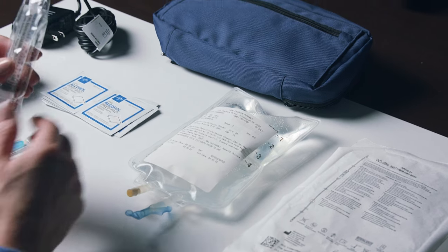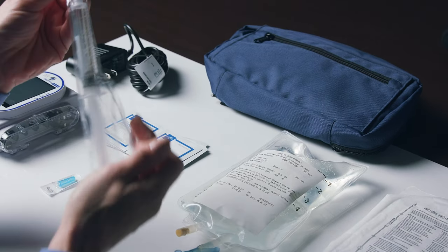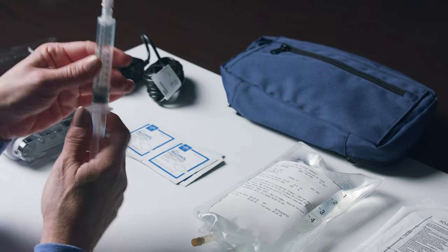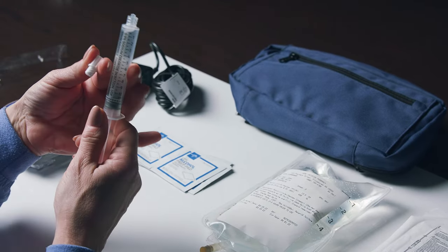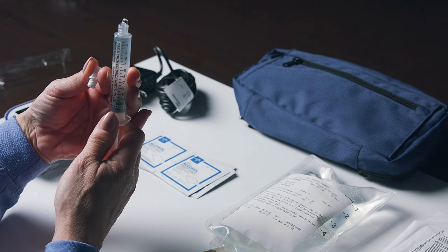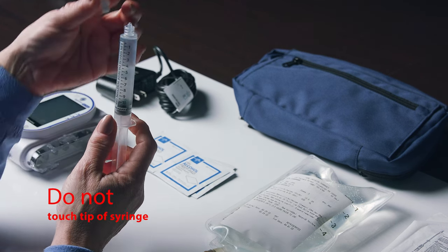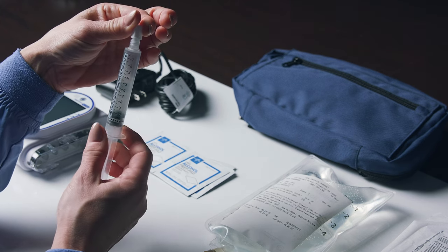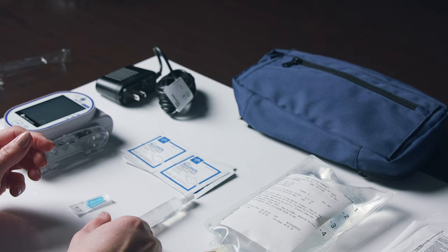Prepare a pre-filled syringe of sodium chloride, also known as normal saline, by holding the syringe upright. Remove the cap of the syringe and gently pull back on the plunger, then gently push forward on the plunger to expel any air that is in the syringe. Do not touch the tip of the sterile syringe. Recap the syringe. Remove trash and clean the area as you go.